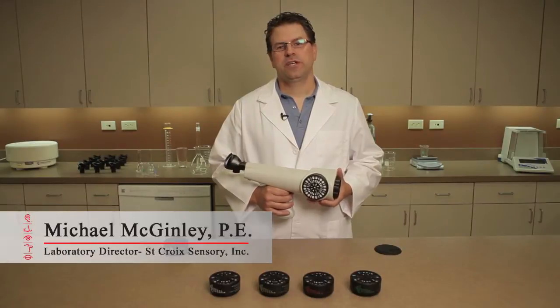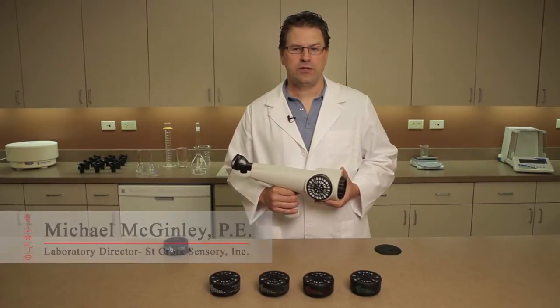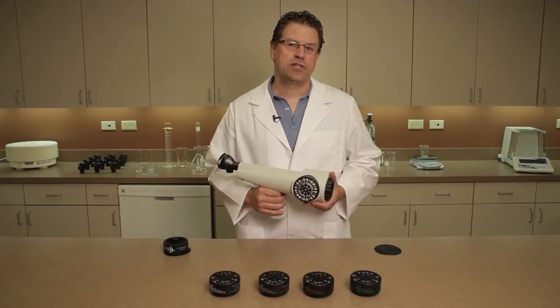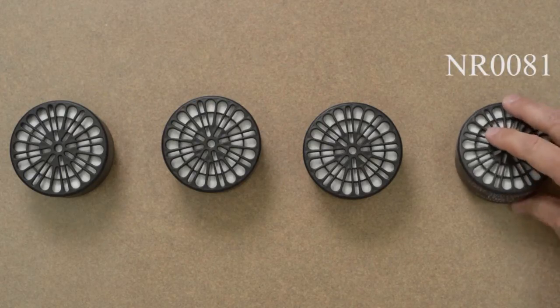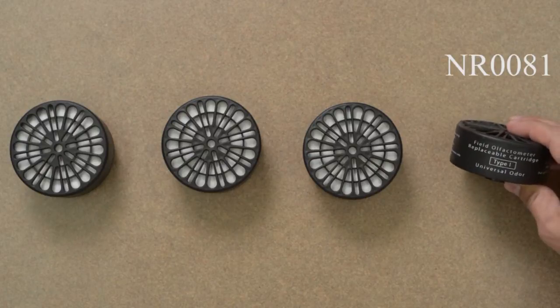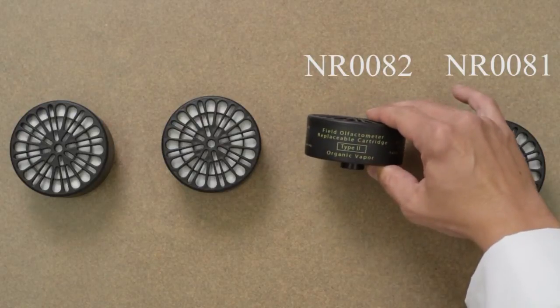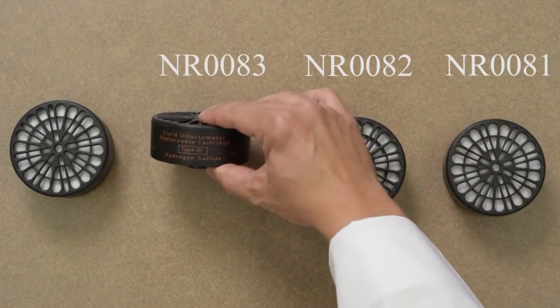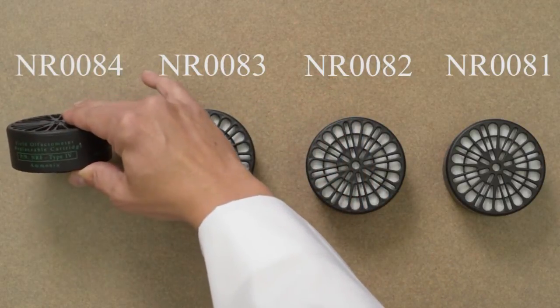Hi, I'm Michael McGinley with St. Croix Sensory, here to show you a few tips regarding our odor filter cartridges for the Nasal Ranger. These cartridges actively filter the ambient odors to create the dilution air for field olfactometer testing. We offer four types: the universal odor cartridge, designed to capture the broadest range of odor compounds; one more specific to organic vapors; a third for hydrogen sulfide and other sulfur-based compounds; and a fourth for ammonia and other nitrogen-based compounds.